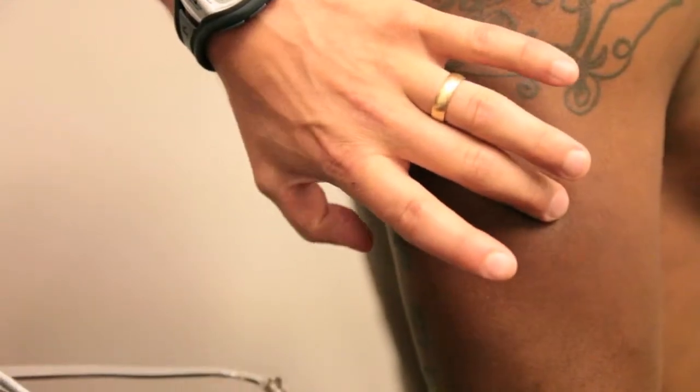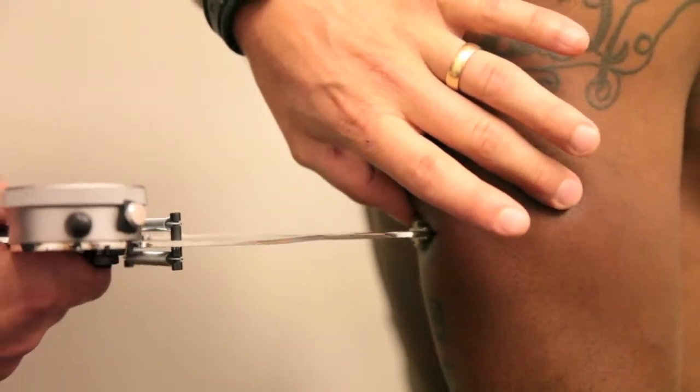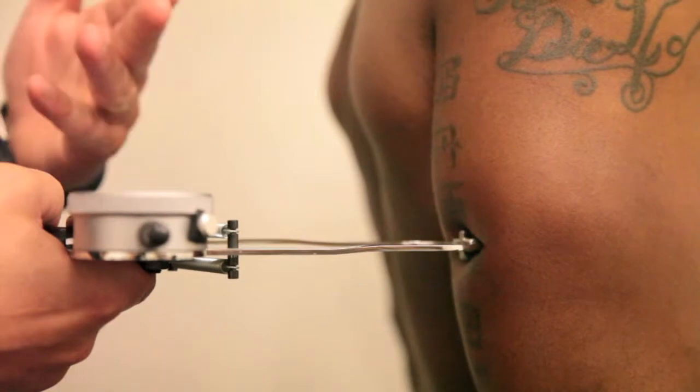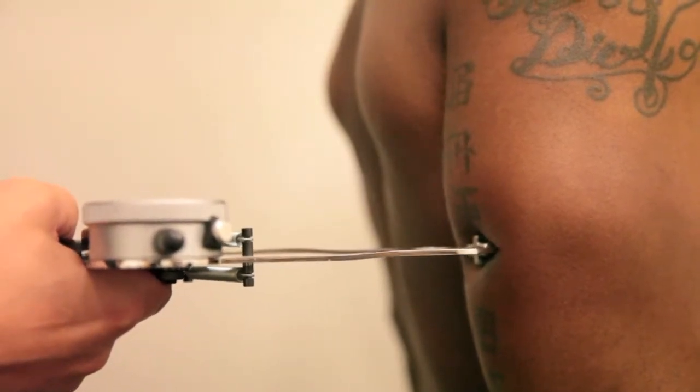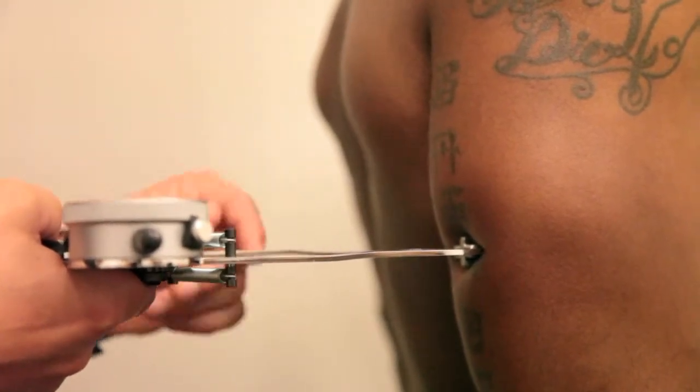We find our point and come around to the middle of the back side of the arm. We'll place the calipers perpendicular to the skin. Always want to make sure they're perpendicular to get an accurate reading.